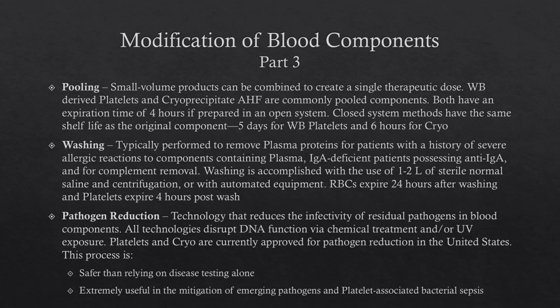Pooling. Sometimes we pool. In fact, commonly we pool blood products, multiple components from different donors into a single pool that will achieve a therapeutic dose. Cryo and whole blood derived platelets are the ones that are most commonly pooled.